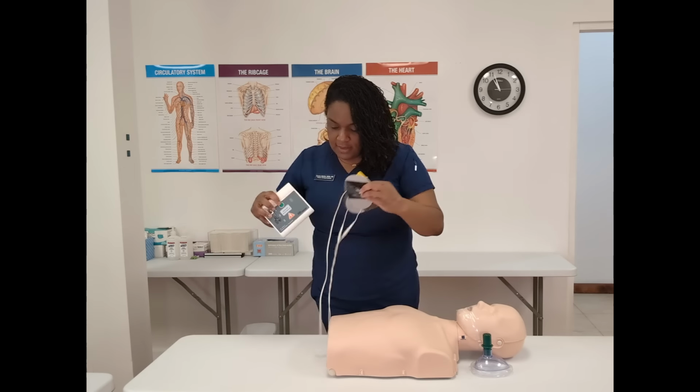All right, so what's the first thing I do when the AED arrives to the scene? If you said power it on, you're correct. Second thing I do, apply pads. Patient's bare chest. Plug in pads connector next to flashing light. If you don't know how to place the pads, follow the instructions that are on the actual pads. Apply pads, plug in connector. Make sure the chest is exposed and clear.